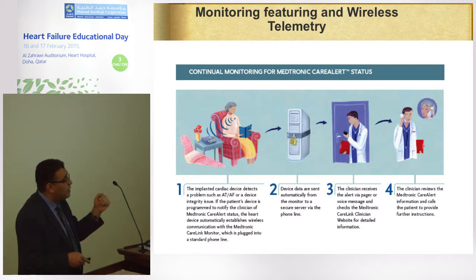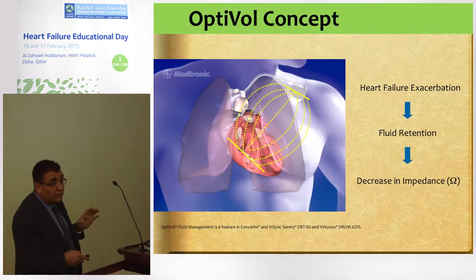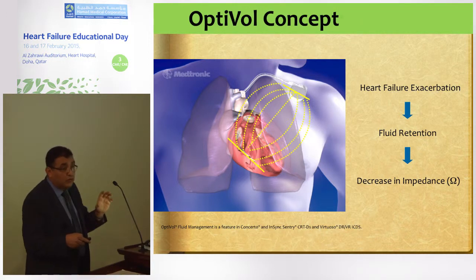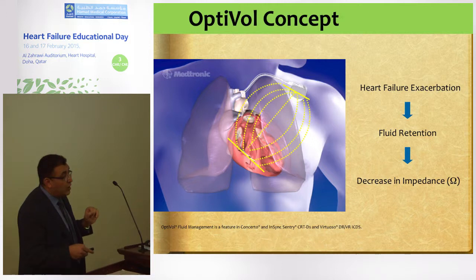We have around 10 of our patients following with this technology. So this is just about the OptiVol. This is also a feature of one of the implantable defibrillators.